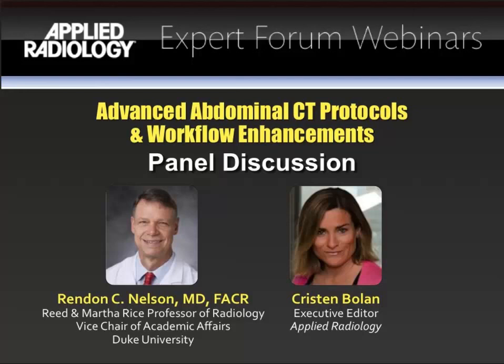Could you describe how contrast injection details are currently documented at your hospital? Sure. We're moving away from paper, but at the current time, we have our technologists and nurses fill out a contrast sheet, which includes a lot of historical information, including demographic information about the patient. It includes the date and the level of their most recent serum creatinine and their eGFR. And then it also includes how much volume we gave, at what rate, whether or not we used the extravasation detection apparatus, and whether there were any problems. We also list the site of the IV and the angiocath type that was used.